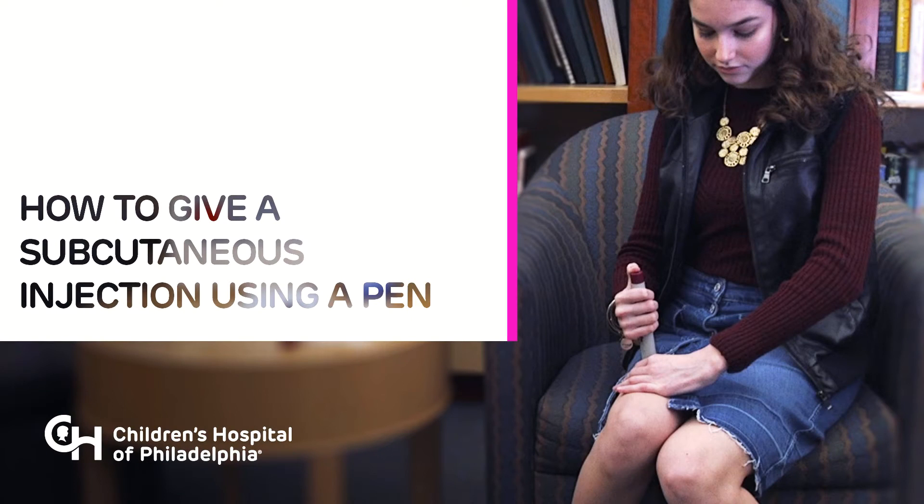This video offers help and guidance for administering a subcutaneous injection using a pen for medicine like Humira. Watch this video and read the Children's Hospital of Philadelphia Patient Family Education Manual handout for more information. Do not try to inject medication until your doctor has decided you can, and you have been taught the right way to give injections by a healthcare professional.